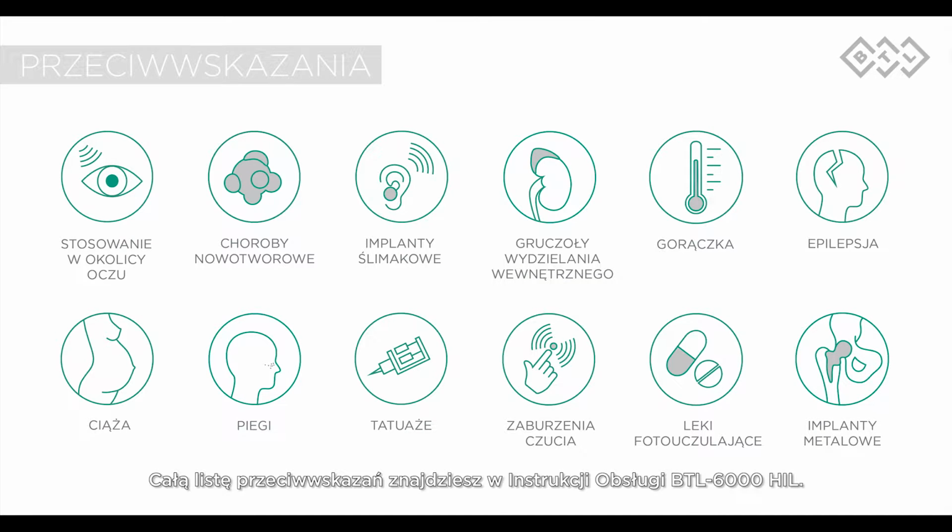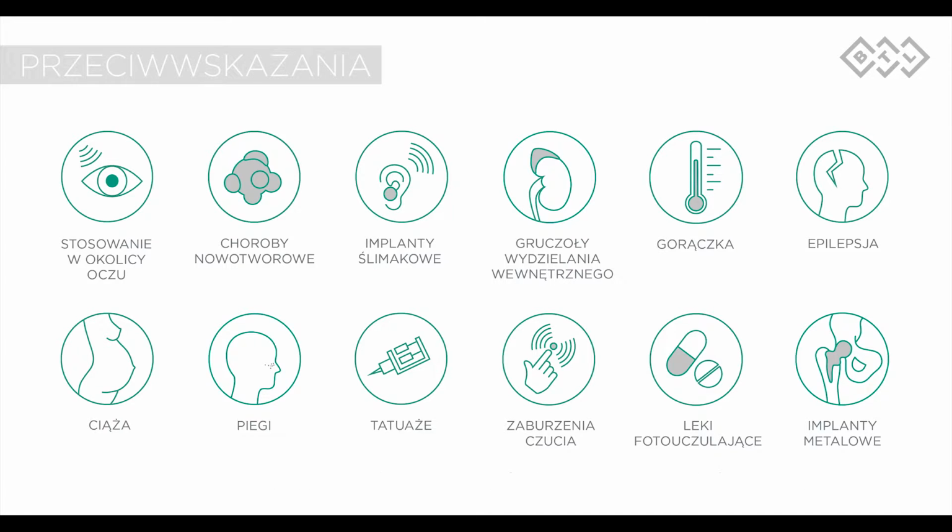For a full list of contraindications, see the BTL-6000 high-intensity laser manual.